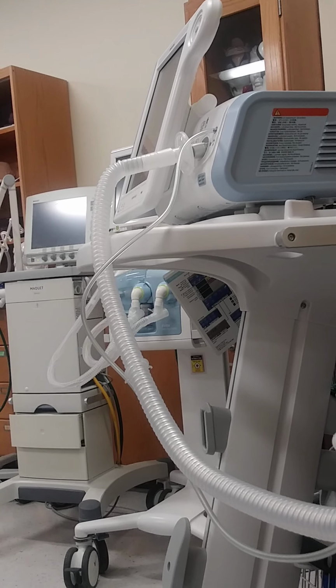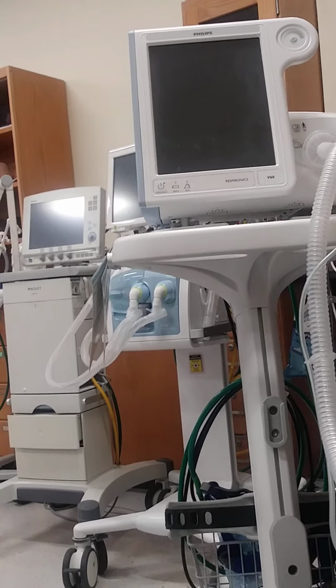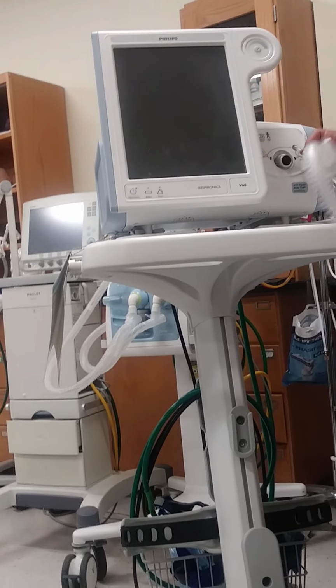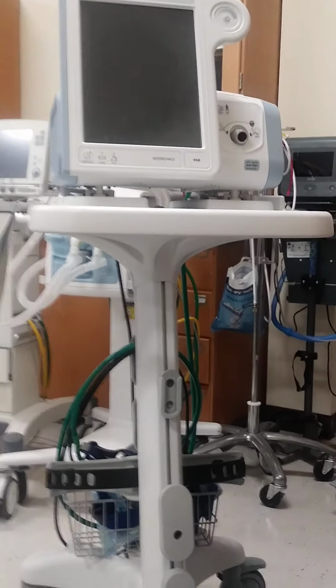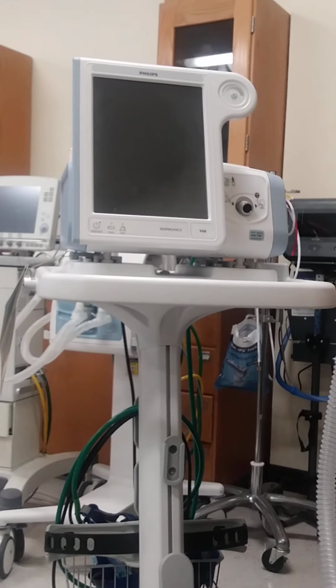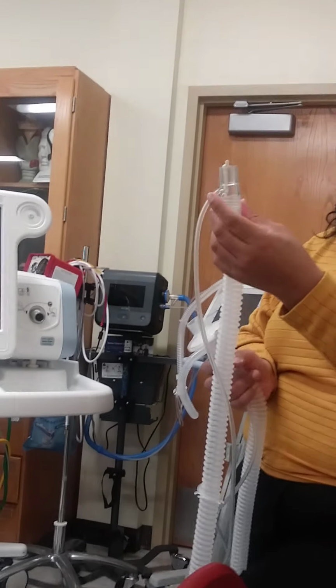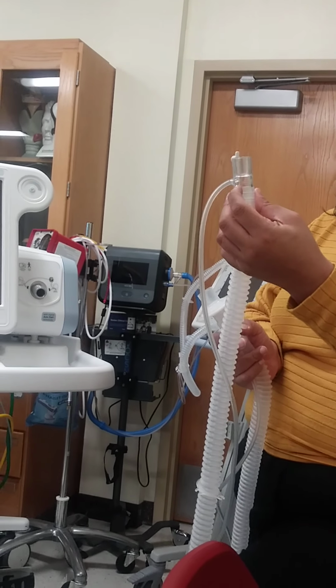All right, so this is a BiPAP, okay? And I'll just go over some of the mechanics of it. So all BiPAPs have a circuit, okay? And they look similar to this. And the circuit is a large bore. This little device right here is, we call it the exhalation valve. Okay, so this little hole is very important.